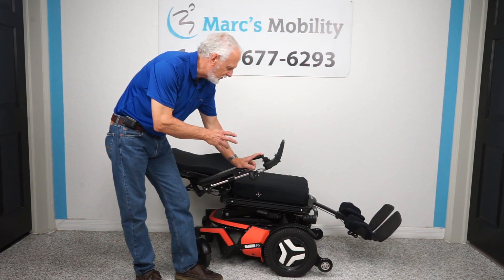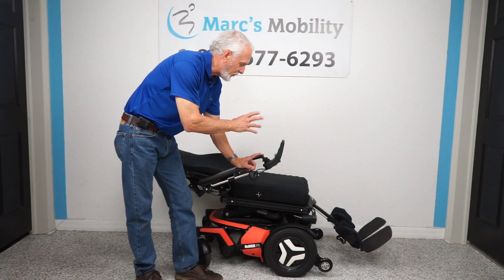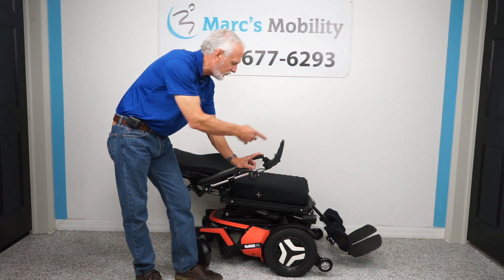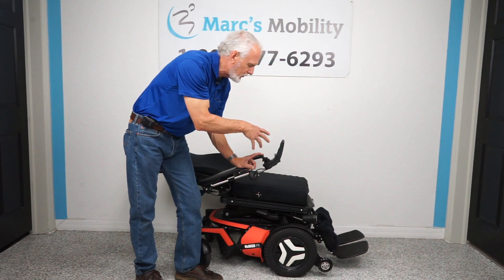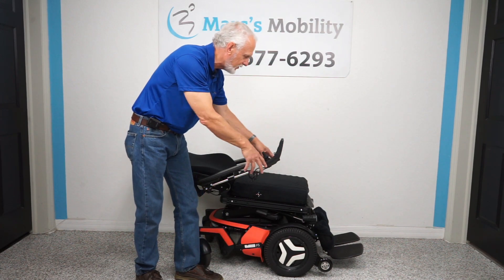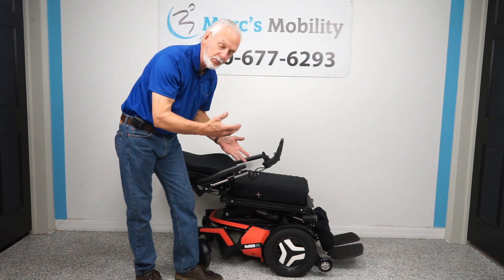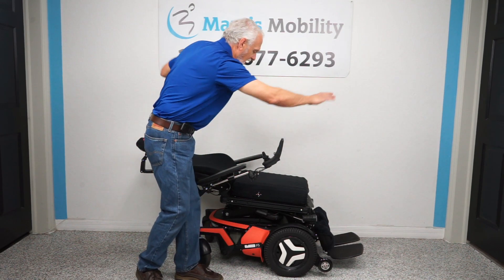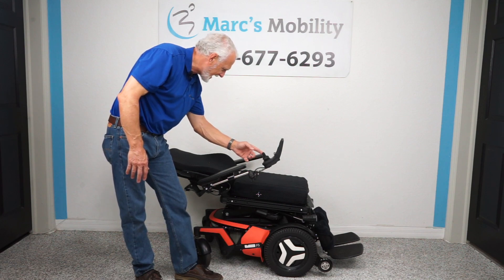This chair has been programmed for a specific person — for example, set up so the tilt and the legs go down at the same time. We'll reprogram it back to factory settings so when you ask for the legs to go down, only the legs go down. These chairs are programmable for several people and different positioning — they can raise the back and the leg at the same time with just one button.